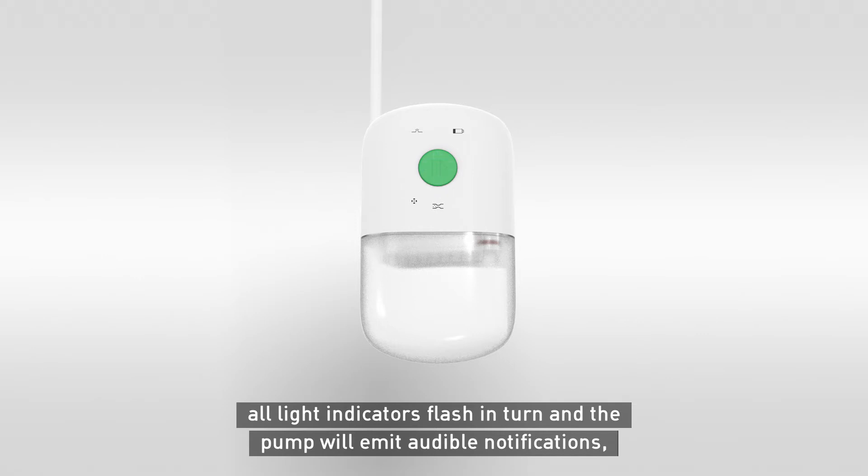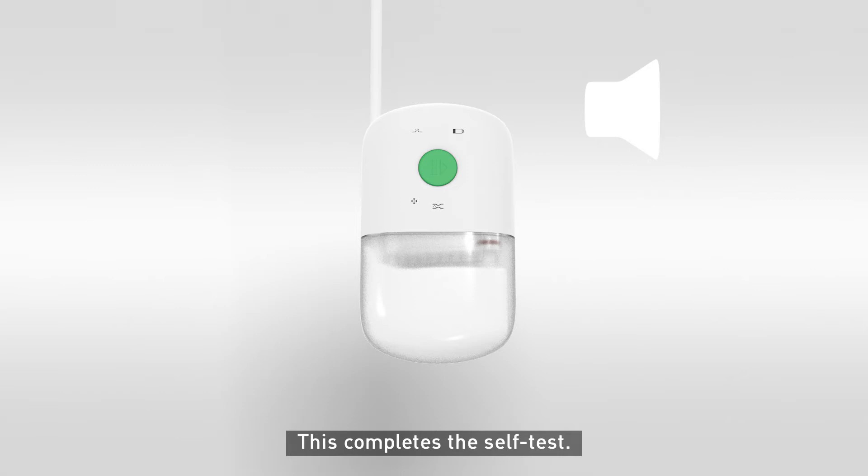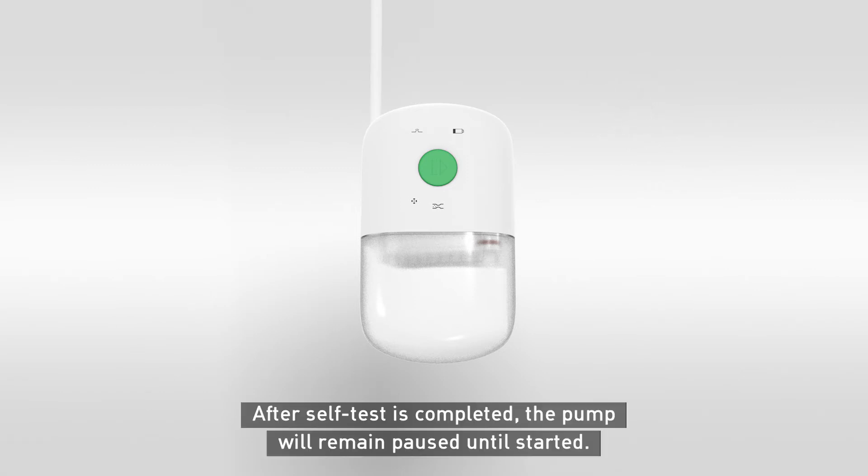All light indicators flash in turn and the pump will emit audible notifications — first in a medium frequency, followed by high frequency. This completes the self-test. After self-test is completed, the pump will remain paused until started.